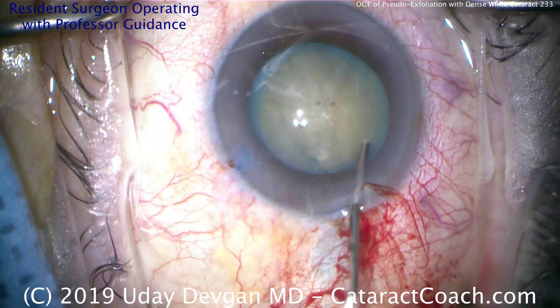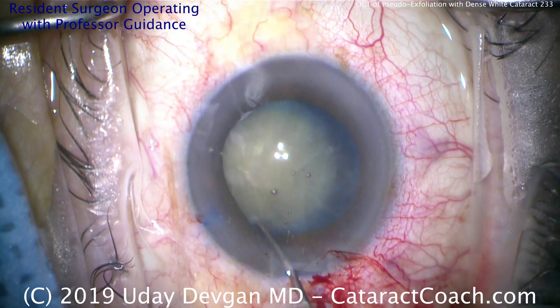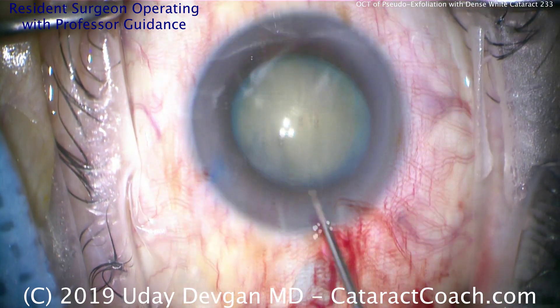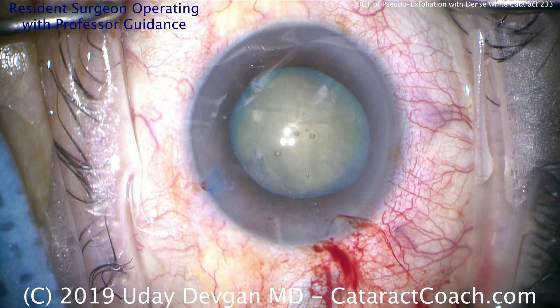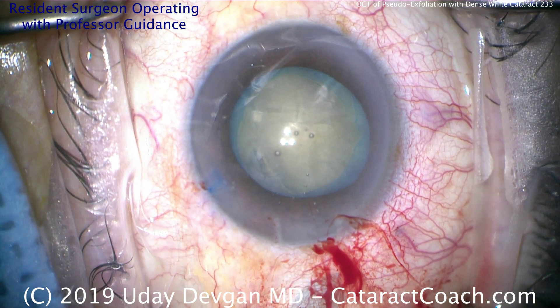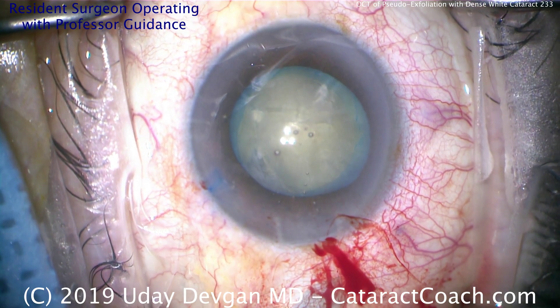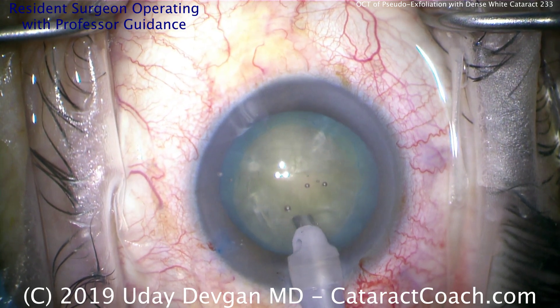Back to normal speed now. Do a little hydrodissection. We have edited the video — total length of the video today is about 15 minutes, while the actual surgical video in real time was about 30 minutes. So give yourself time for this; there's no rush. We just want to make sure we do a beautiful job. For this resident, we're going to do a stop and chop technique.